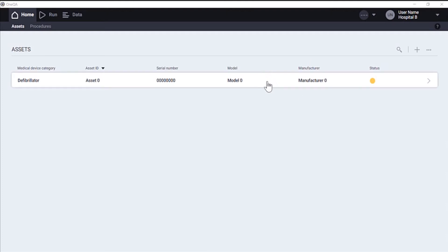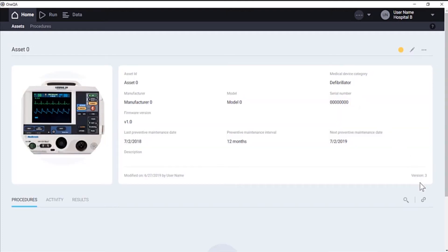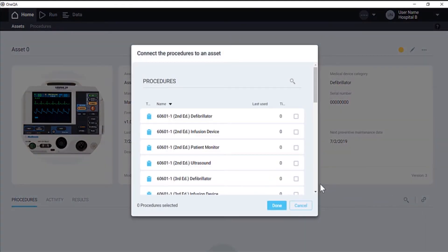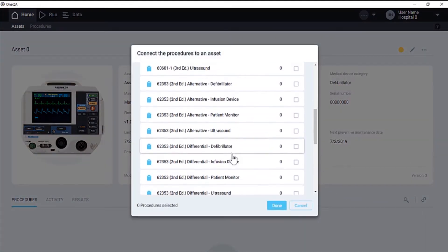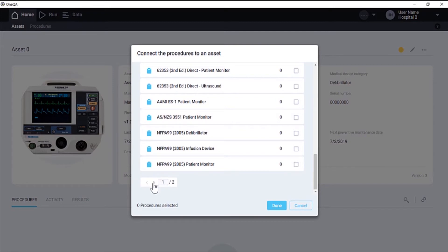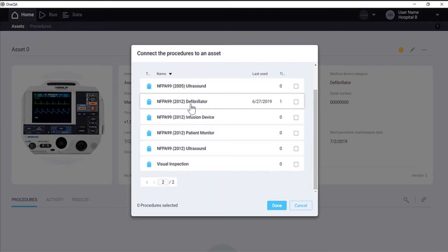Here in our list of assets, we can see our defibrillator and that it's due for service based on its status indicator. Before running the procedure, we'll need to link a procedure to the asset and we'll use a procedure designed to adhere to the NFPA 99 standard 2012 edition tailored for the defibrillator class of medical devices.